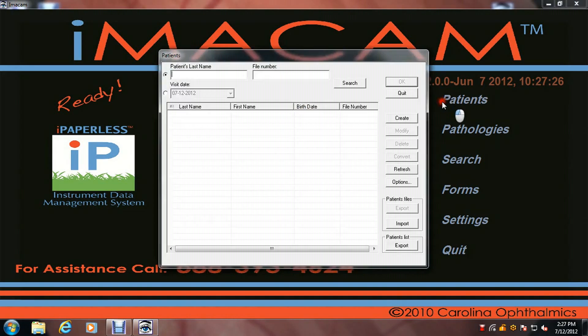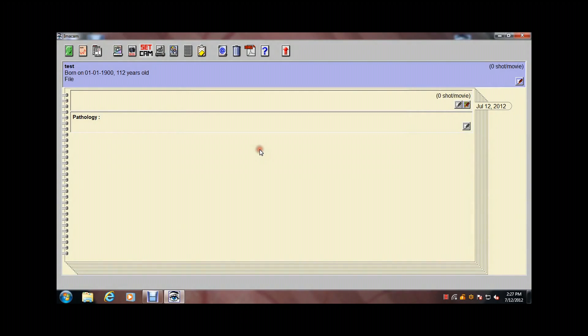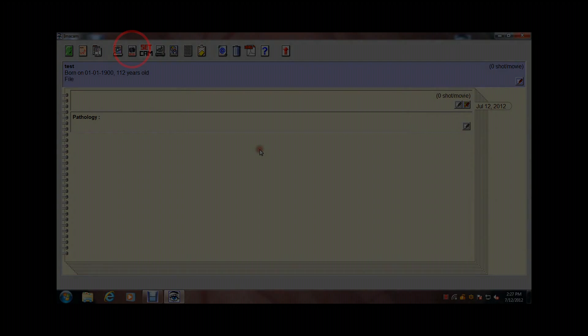Next, to go into capture mode of iMacam, left click the mouse once on the Canon digital camera icon. The screen will now turn black. You are ready to acquire pictures.